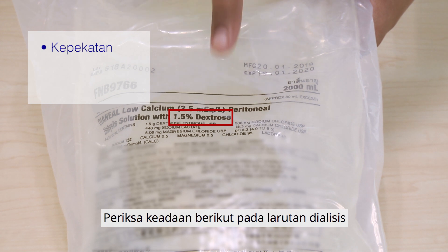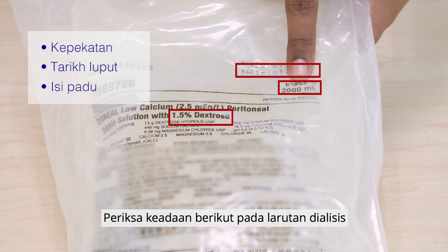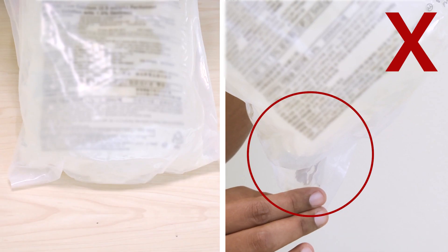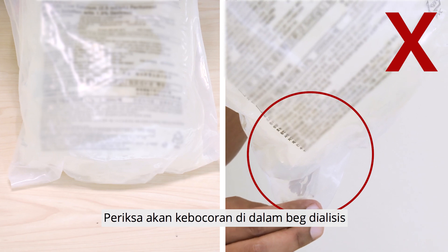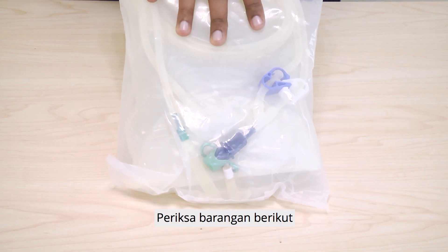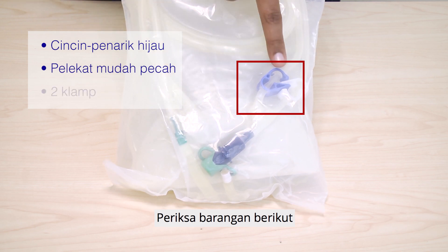Check the concentration, expiry date, and volume of the dialysis solution. Check for leaks in the dialysis solution. Check if the green pull ring, frangible seal, and the two clamps are present.